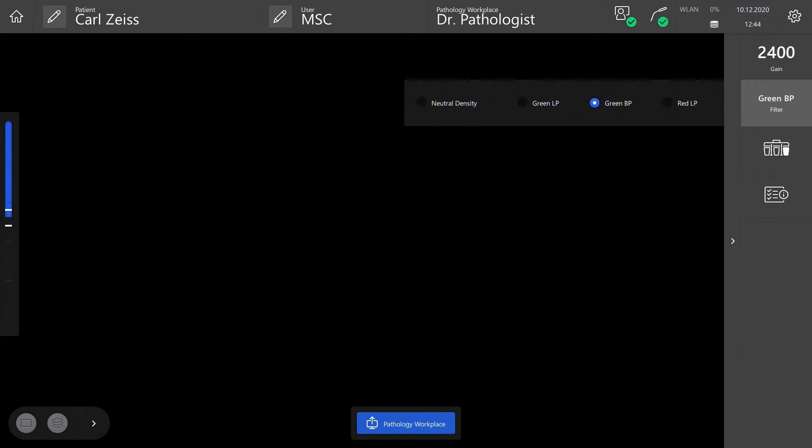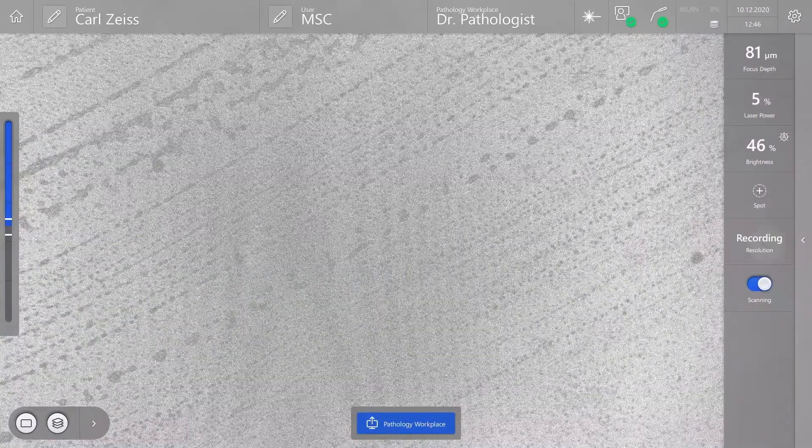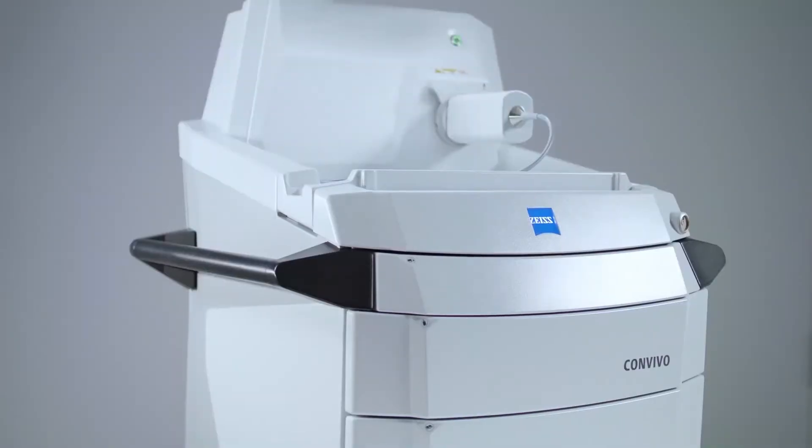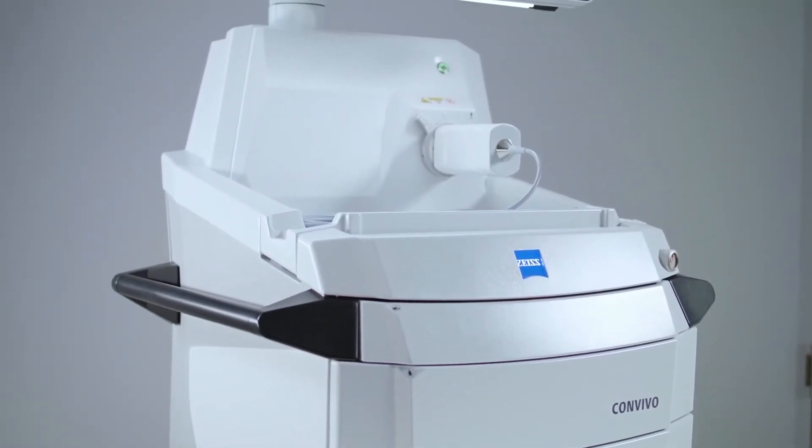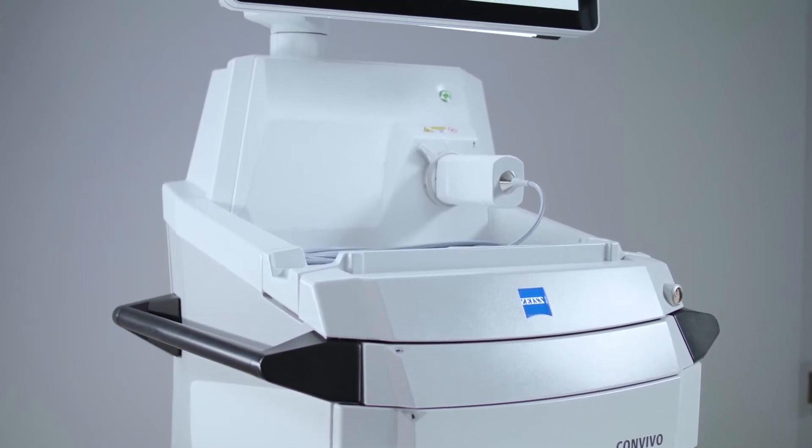Set filter back to green band pass filter and change resolution to live image. Now Zeiss Convivo surgical workplace is ready to be used during surgery.